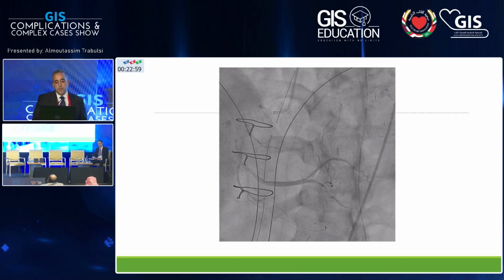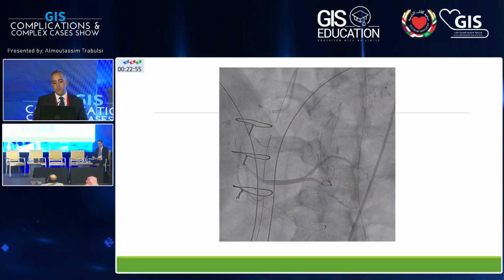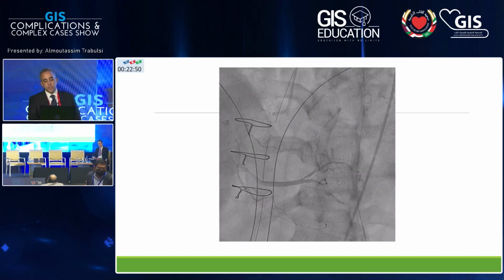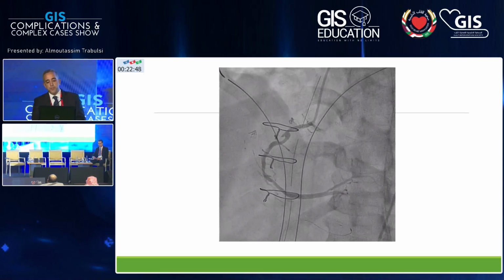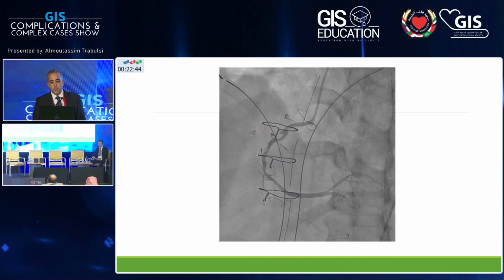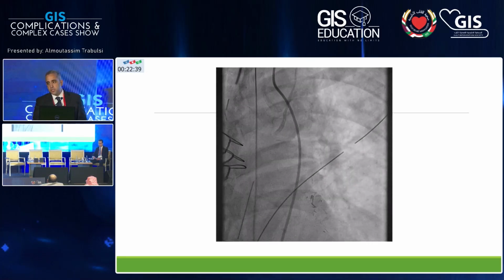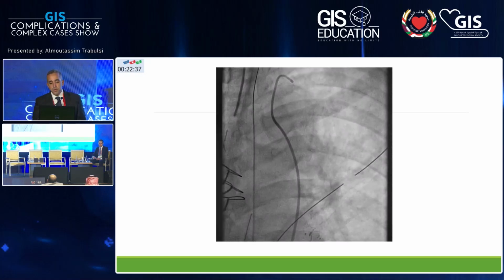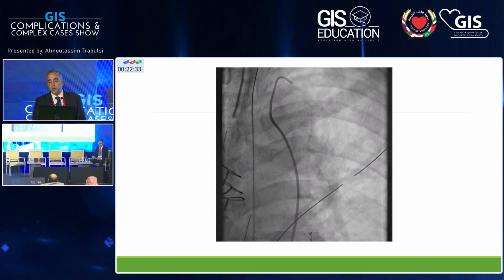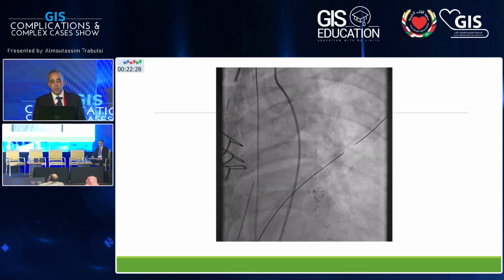The RCA, the proximal mid-RCA looks almost unchanged. However, if you look distal to the mid-posterior descending coronary artery, you notice that there's loss of flow in the PDA, which can explain his symptoms and why he decompensated as well. However, this is his LIMA now. So he lost his collaterals from the distal PDA, and also lost his LIMA that was just placed in the operating room.